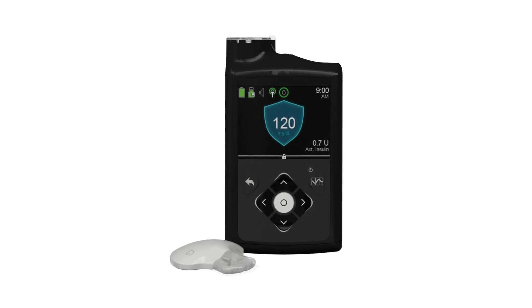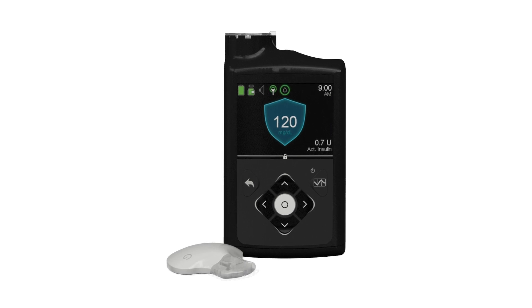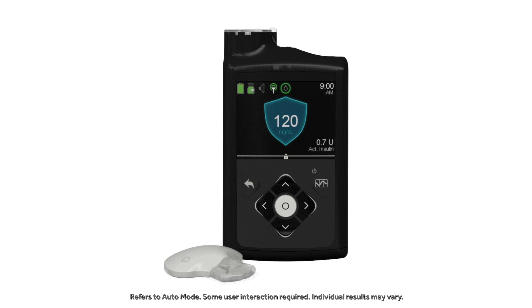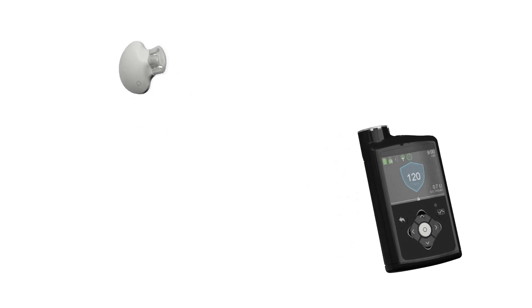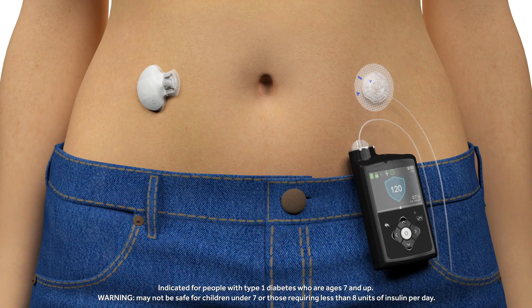The MiniMed 670G system is the first FDA-approved insulin pump system that automates and personalizes the delivery of background insulin, also known as basal insulin. The system consists of two integrated components: the MiniMed 670G insulin pump and the newest, most advanced sensor from Medtronic, the Guardian Sensor 3.